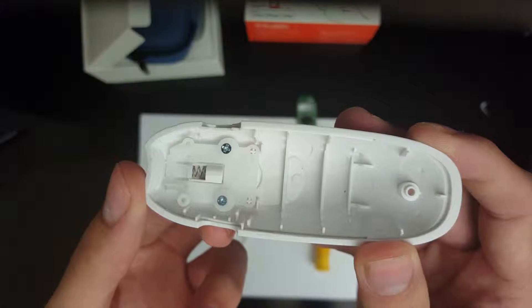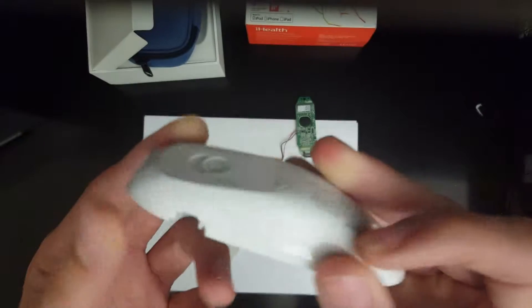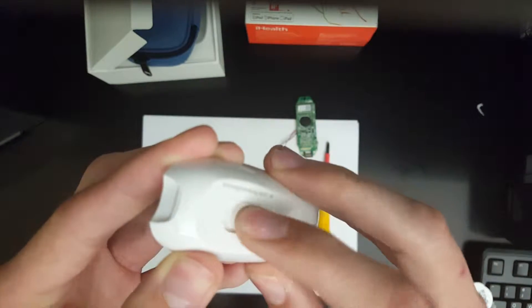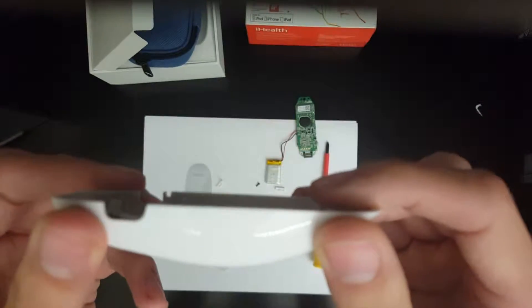Beneath the battery is the final component: the strip ejection mechanism. You can see that the spring here is integrated into the lower shell, and it functions via a simple button push, which removes the glucose test strip from the port of the device.